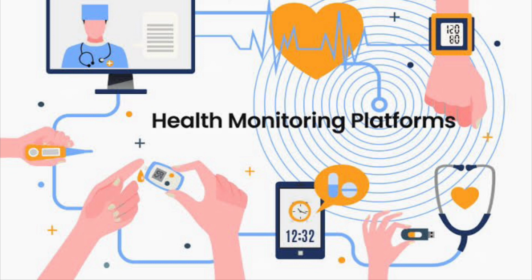Naturally, if you have identified the need very clearly in the beginning, that will help to narrow down the goals you set. These goals should focus on impacting your practice and patients. Definitely, it should lead to improvement in patient care. There should be metrics by which the quality of healthcare has improved by implementing this. There are four areas of value one should consider when you define that a project is successful. The first is health outcomes. There should be a definite change in the health outcome of patients who undergo this monitoring.